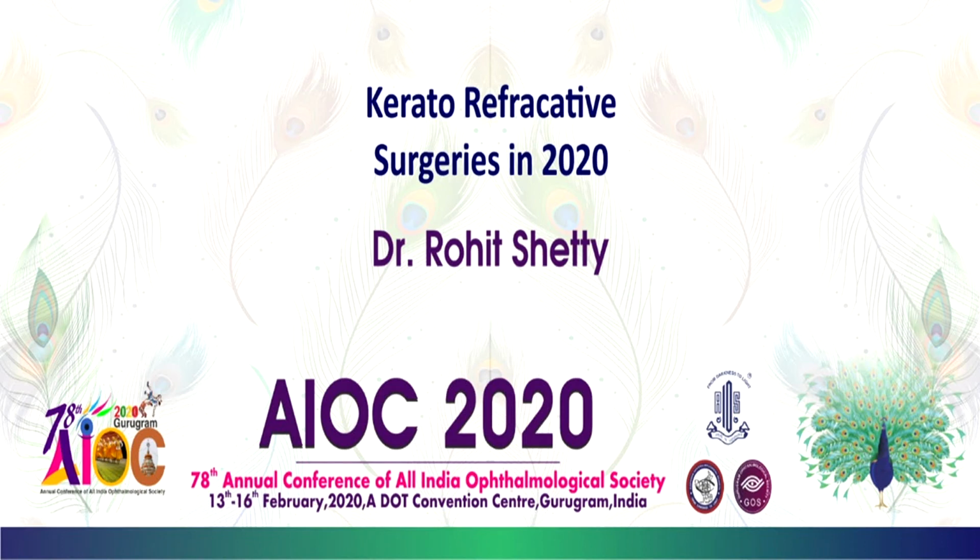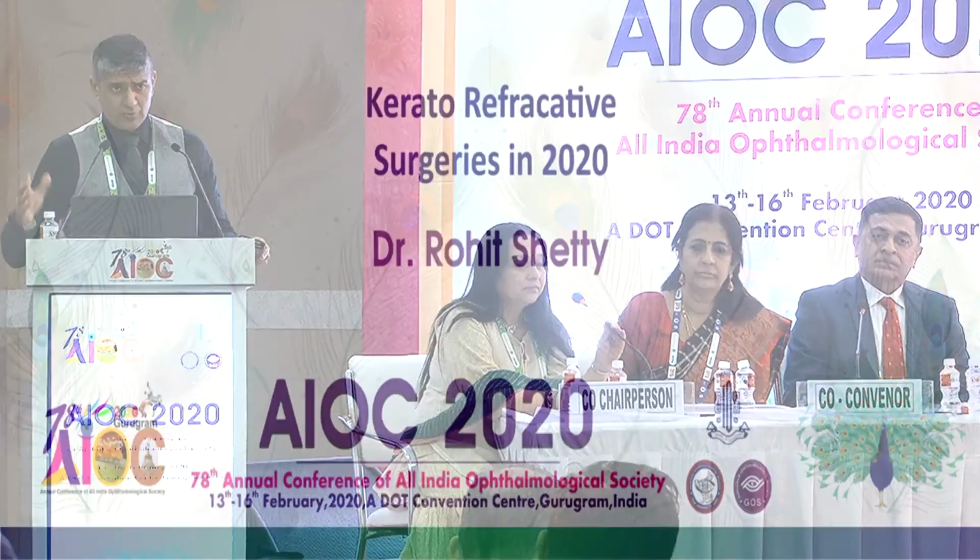You do not prefer multifocal lenses, and basically it's important to use a good formula. We like to use the Barrett True-K; we have done about 3 patients right now, post-presbyopic LASIK who developed cataract. You don't use a negative aspheric lens. You use either a plano, neutral aberration lens, or positive spherical aberration, and you target minus 1.5 to minus 1.75 in the non-dominant eye, because they are already used to this, so they are very happy after the procedure.